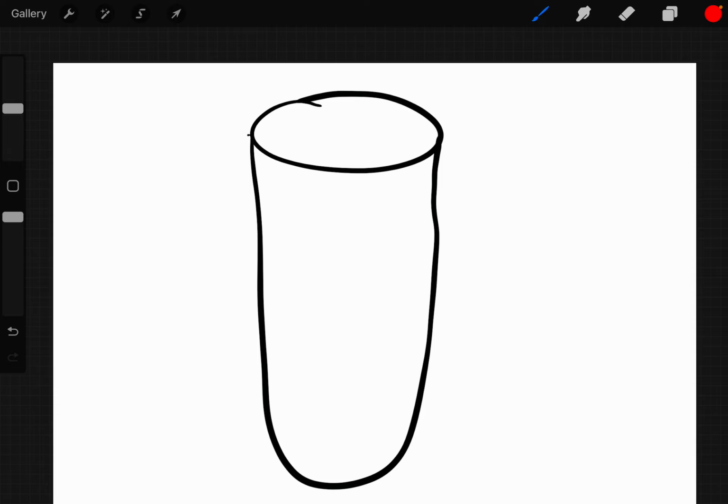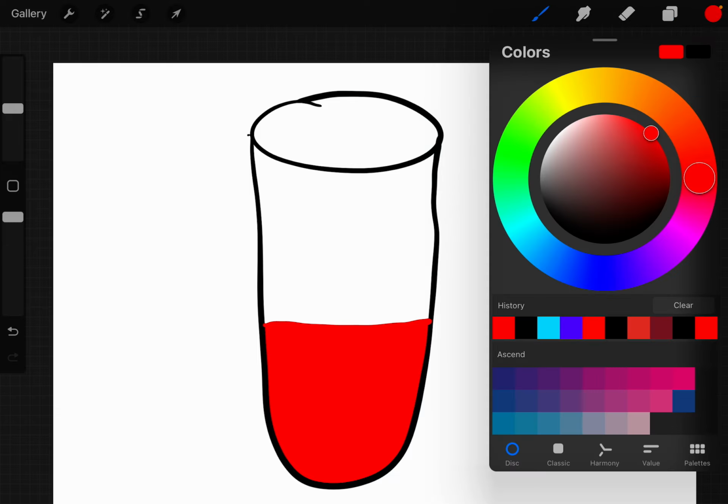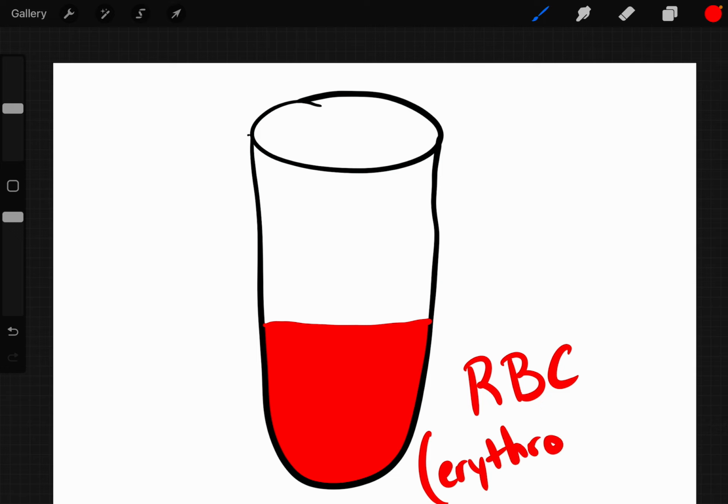So the centrifuge spins around. You've got a couple sections I'm going to point out. So the way it works is the thing will spin, it'll kind of fill up, it'll put the blood into different sections. You'll have that part, which is the red blood cells. We'll label that red blood cells, which will be called in class erythrocytes.